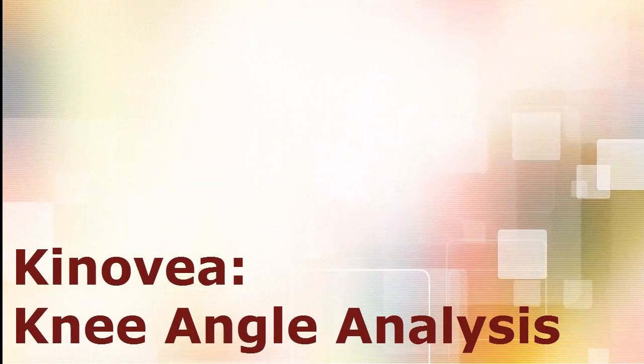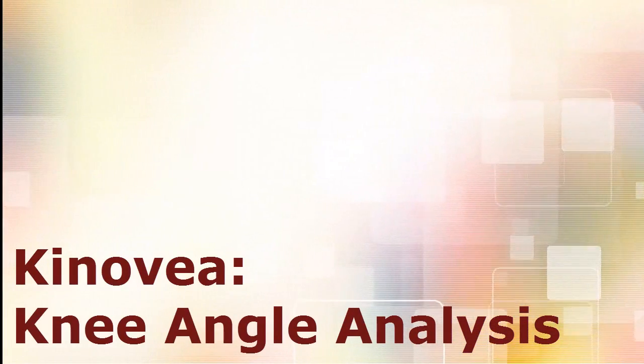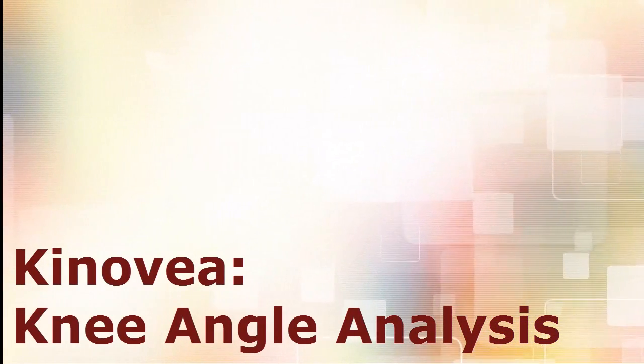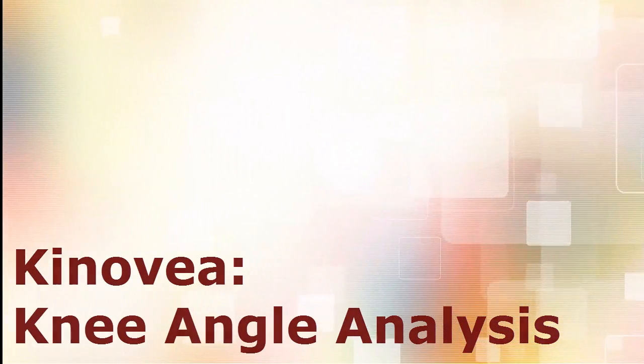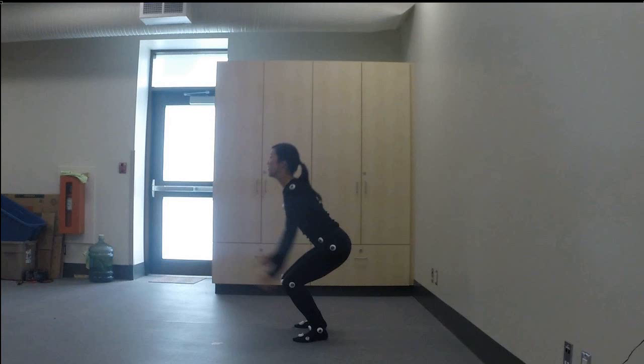This video is going to cover how to track paths and then perform an analysis on the angles. For tracking any joint, three segments are required: a proximal, middle and distal marker.